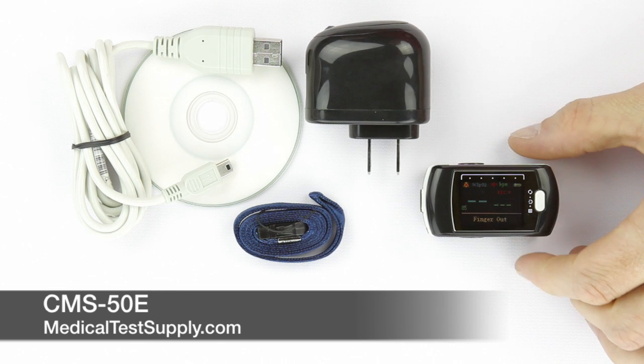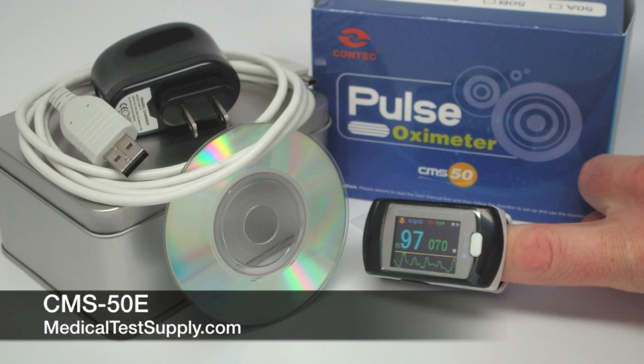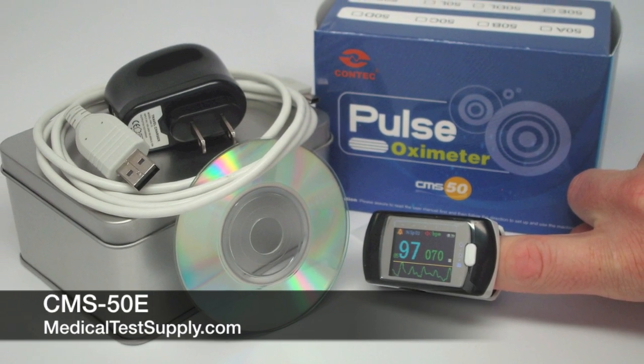This oximeter is well suited for physicians, healthcare providers, clinics, hospitals, and all types of patient monitoring.